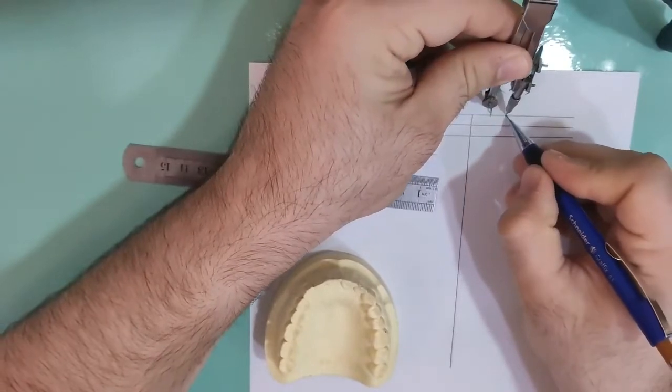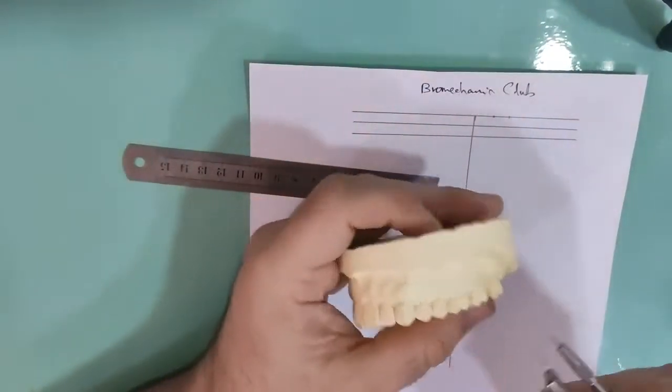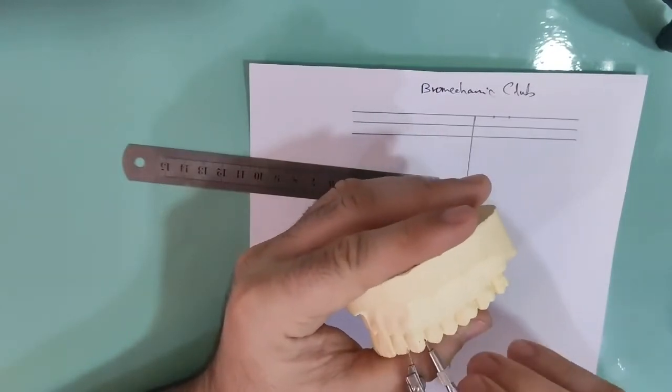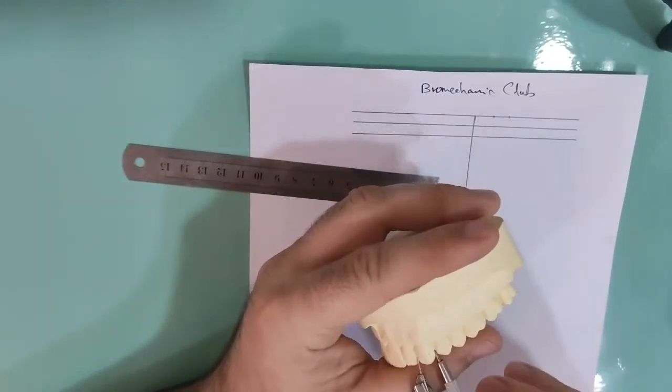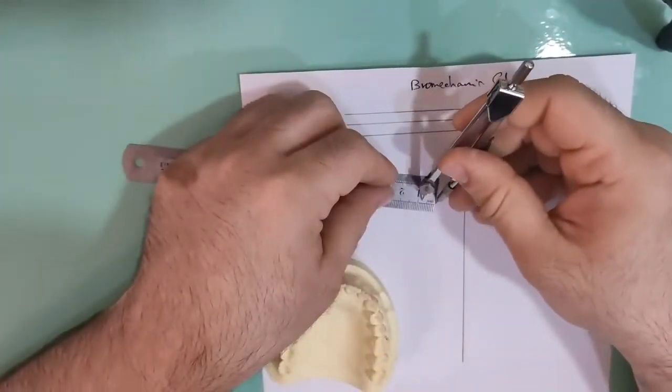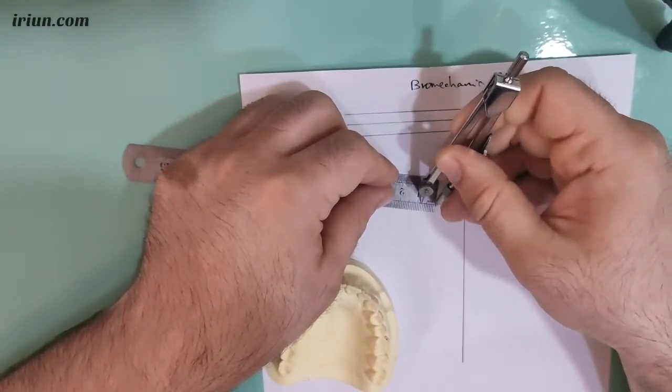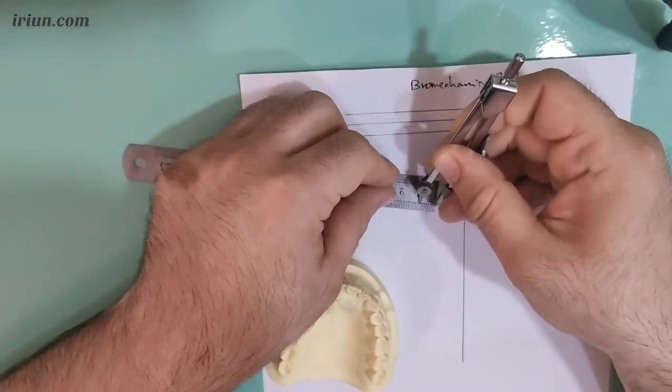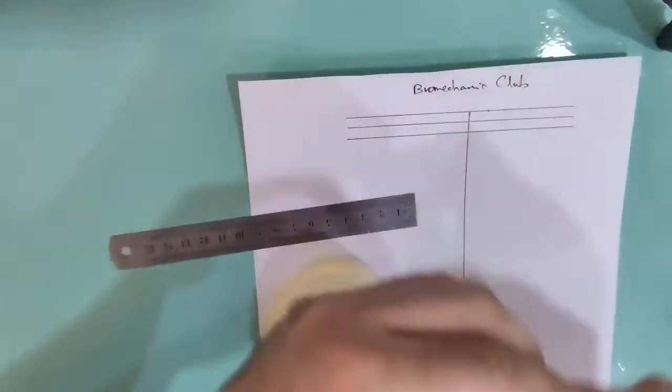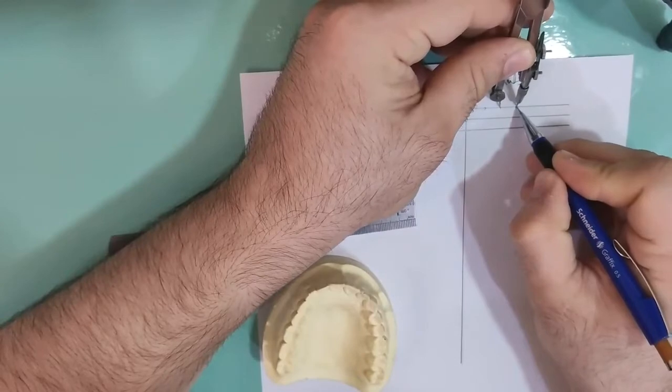We draw a point on this line. Finally, we measure the measured distal width of K9, and we have here eight. We add one millimeter, so it's nine millimeter. And draw a point here.